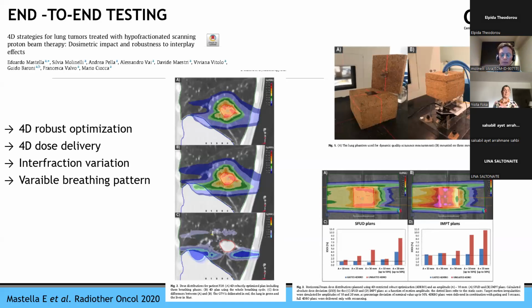The important part of this is just the study with protons, but we repeated it with carbon ions. We tested different robust optimization techniques. We even tested different spot sizes for carbon ions. And we also made an in-house phantom, which is much simpler than the one you saw before, but anyhow, it mimics a lung, with water inside here, and those are pinpoints.